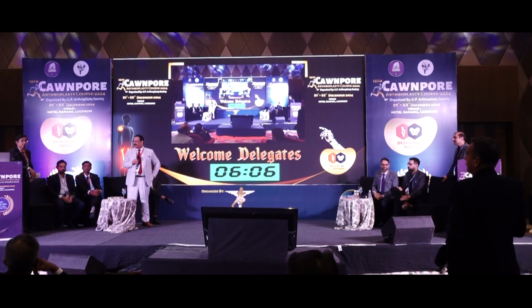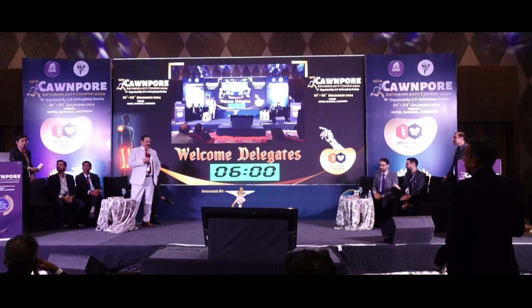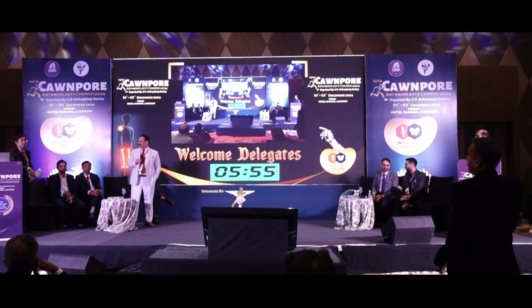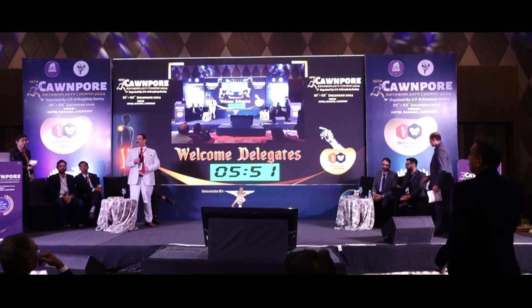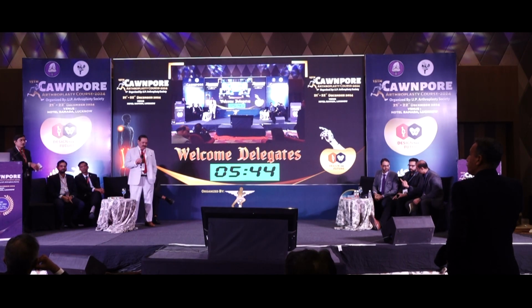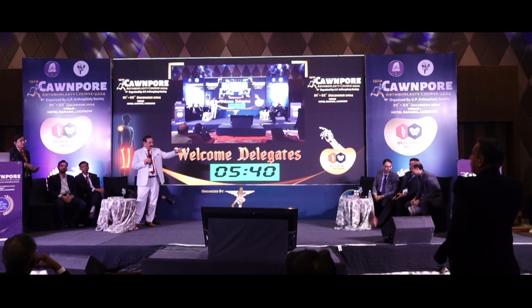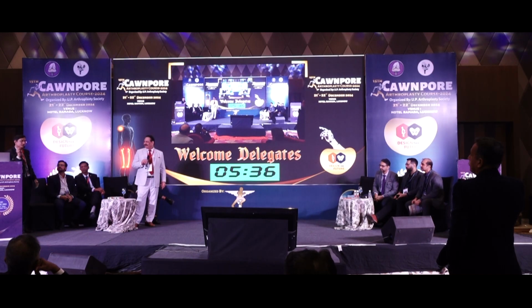I see patients 25 years, 30 years, bipolar done 4 years back for neck femur, which I think should not be done. If you want to do any replacement, a total hip is going to perform much better for a longer time than a bipolar in young people, in active people. Bipolar should only be done, as sir also pointed out earlier, in patients who are homebound or who are not community ambulators. And in these patients also, who would go in and out, that's difficult.